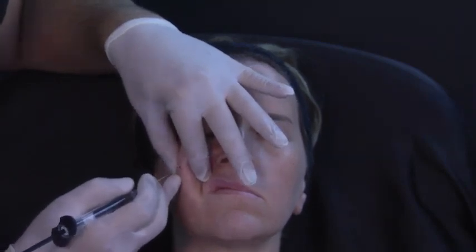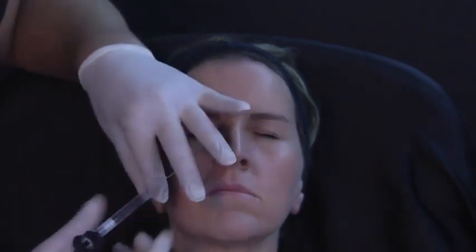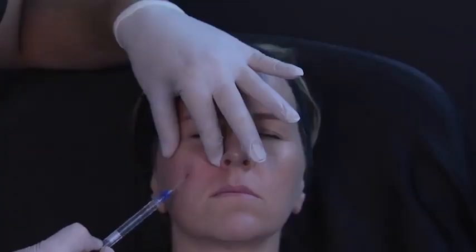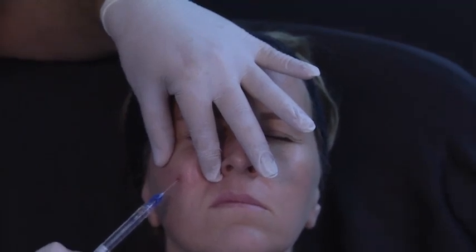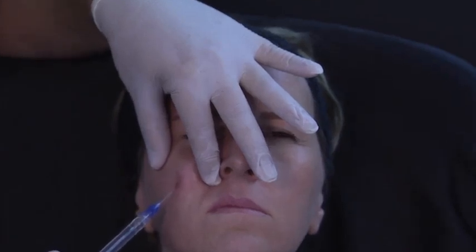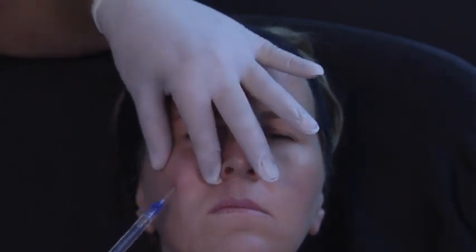First, we captured the 3D structure of the anatomy of my personal assistant in my clinic in Mexico. Her name is Natania. We'll call her Natania, right? You can see her there. Then we created, with innovative software, all the anatomy in 3D. After that, through facial landmarking, we adapted that technology to that bone structure, so it's personalized. The anatomy is almost her anatomy. It's not exactly her anatomy, but it's very close.